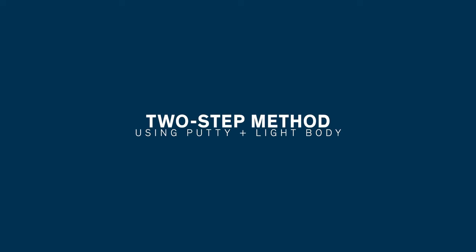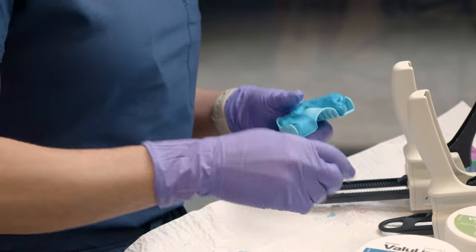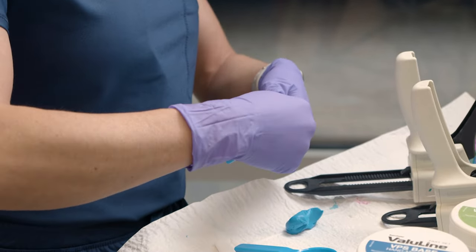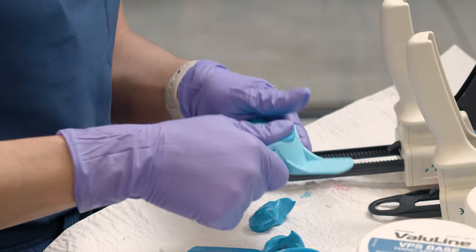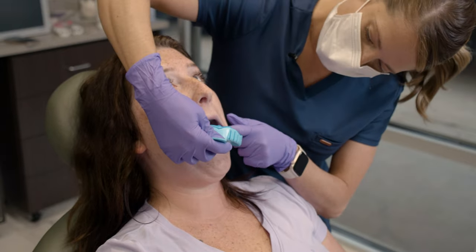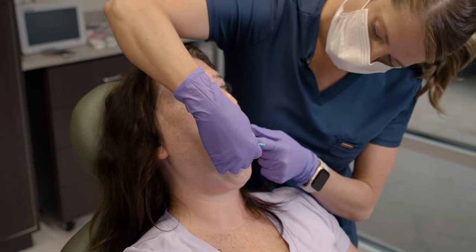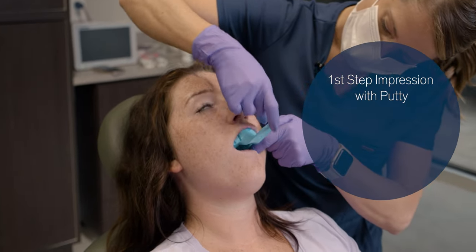The two-step approach utilizes either heavy body PVS material or a putty, fully loading the tray with that material and taking the impression. You do want to use more putty than you would for a one-step impression, so you will want to load the putty material all the way up to the flanges.